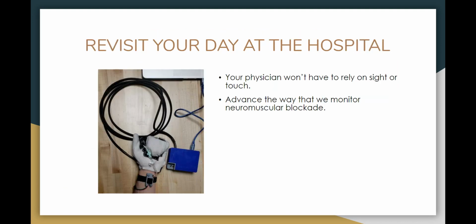So let's revisit your day at the hospital. We hope that in the future your physician won't have to rely on sight or touch, and we hope to in this way advance the way that we monitor a neuromuscular blockade.